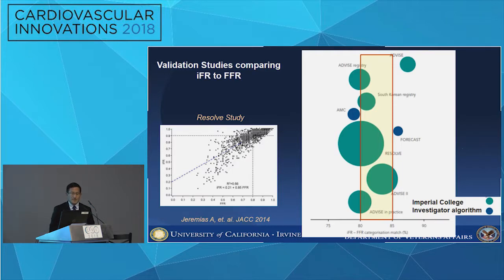And I think one of the questions is, perhaps we can't show a difference in this range because they're borderline ischemic anyway. We used to use a 0.75 cutoff for FFR. Now we use a 0.80 cutoff. There's no real reason why it needs to be one of those or the other. It's just that one is a little more conservative than the other. And perhaps our outcome studies are starting to show that the benefit of PCIing something in the 0.79 range for FFR may be unclear.